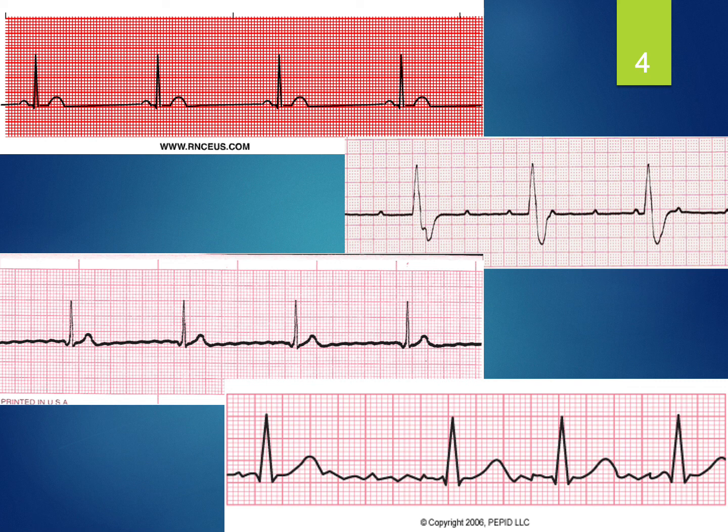This last one is pretty rare, but just keep in mind, all of these strips have something in common. It's a slow heart rate. There's not enough R waves. And remember, we're not only concerned about the heart rate itself, because we have rates of 30 and 40 here, we're also worried about what our patients look like. Yes, these rates are slow, but is that enough to perfuse our patient's organs? What are we going to see in our patient if this is not enough, if we're having symptomatic bradycardia?